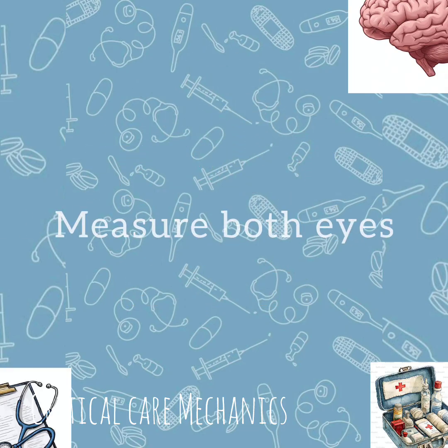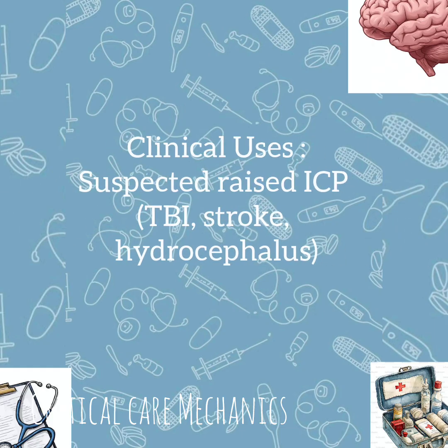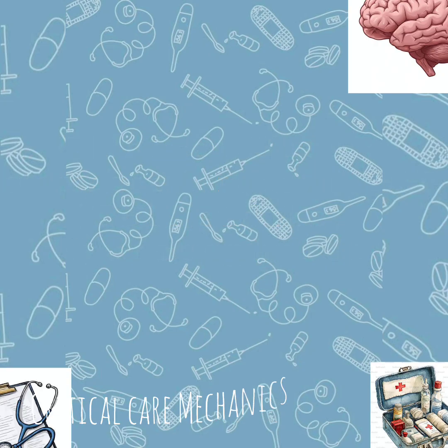Key tips for accuracy: measure both eyes, take the average of multiple readings. ONSD correlates reasonably with invasive ICP monitoring.